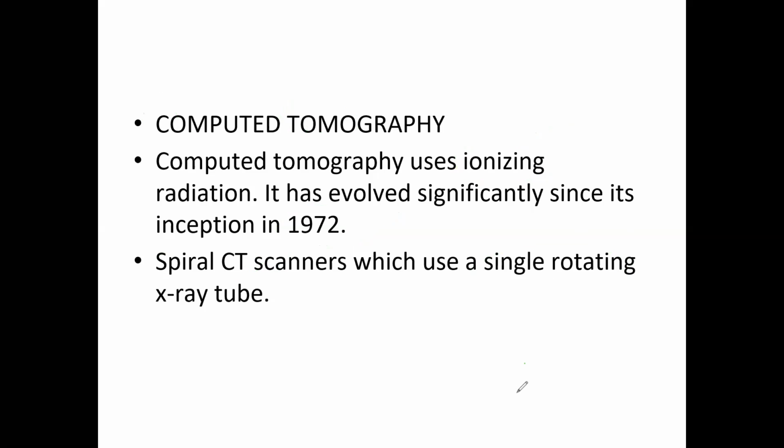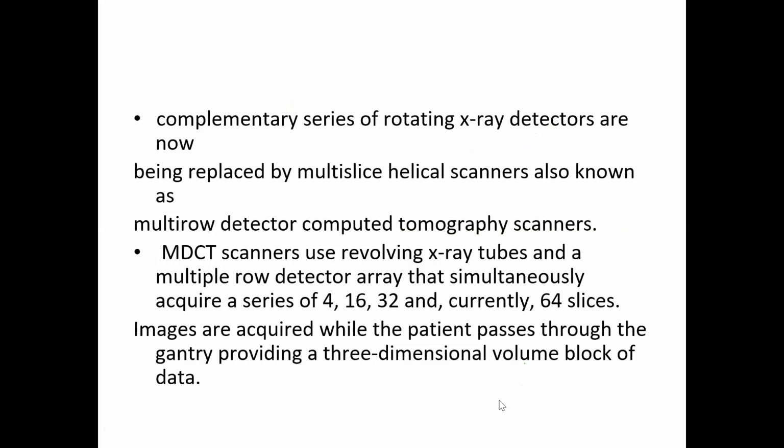Complementary series of rotating X-ray detectors are now being replaced by multi-slice helical scanners, also known as multi-row detector computed tomography scanners.